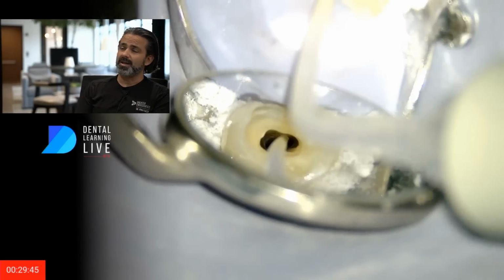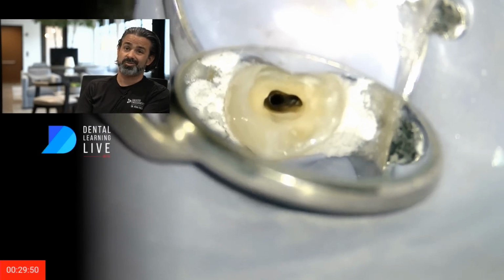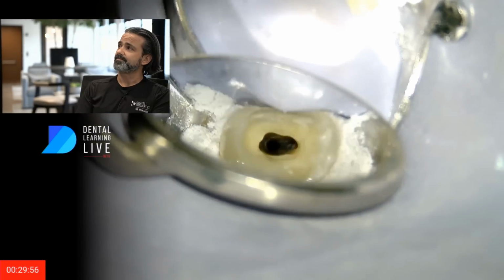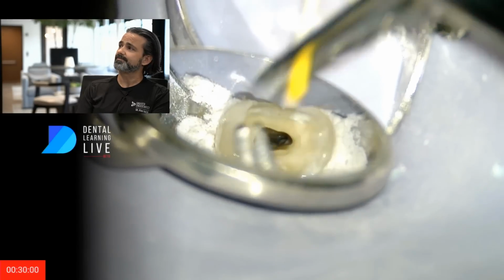And then I'm going to flush again with some EDTA. These are pretty small now. You know, I'm still in the 20 size. I'm using a 20 rotary. And now I'm just going to paper point dry. 29 minutes into the case.